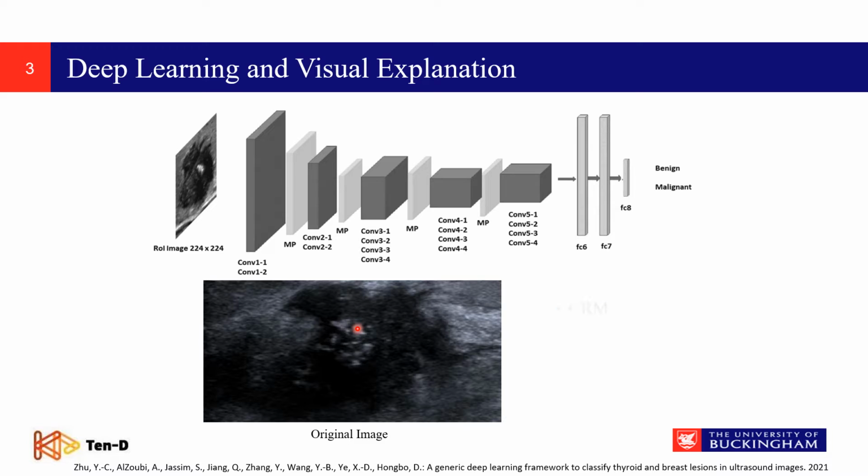To do this, in this paper, we investigate the importance of calcification points as a strong feature of malignancy. The reason that we choose calcification is that many lesions with calcification might have clinical assessment like biopsy. And we visualize our network with three different visualization techniques. One of them is CRM, another one is GradCam, and we also adapt another method which we call entropy GradCam, that we will talk about in following slides.